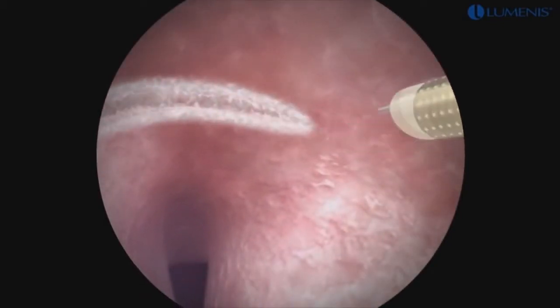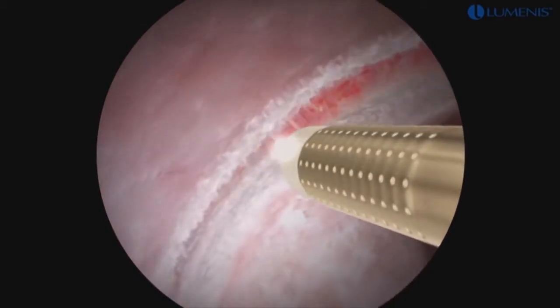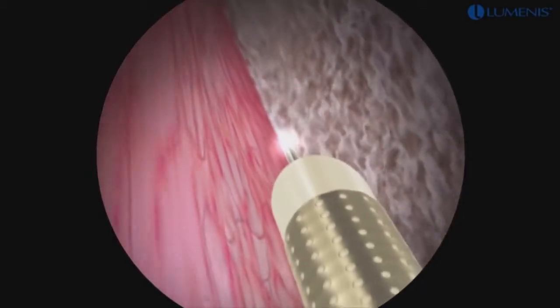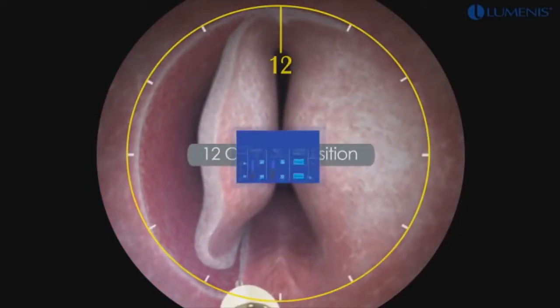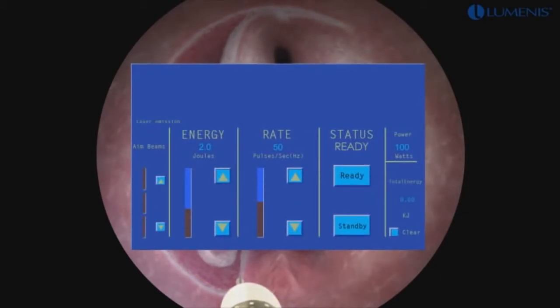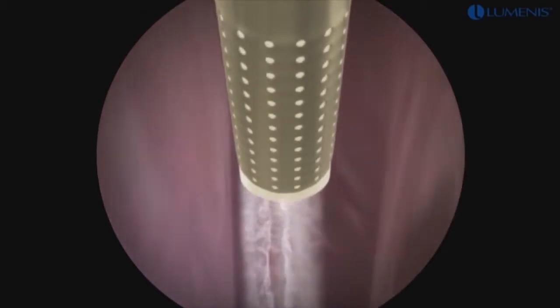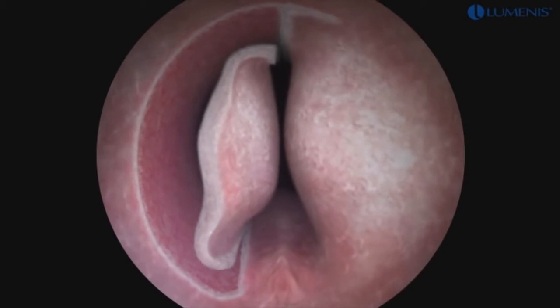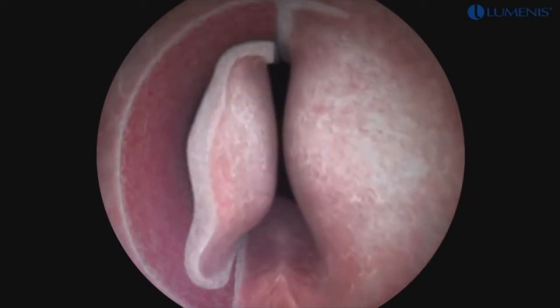The lateral and anterior wall of the right lobe is then freed from the surgical capsule by proceeding along the already defined plane. The dissection continues anteriorly and proximally until reaching the bladder neck. For the 12 o'clock incision and the creation of the anterior groove, the laser settings are adjusted to 2 Joules and 50 Hz. Turning the resectoscope 180 degrees and starting at the bladder neck, a groove is cut along the anterior commissure until the level of the verumontanum is reached. When working close to the sphincter area, you may want to modify the laser settings to 2 Joules and 20 Hz to prevent external thermal damage.